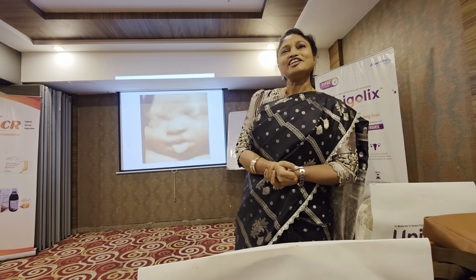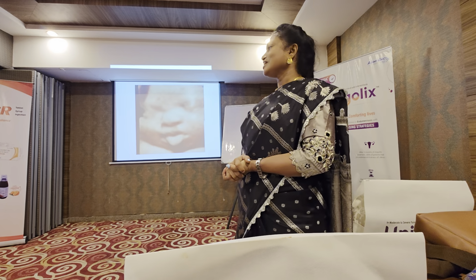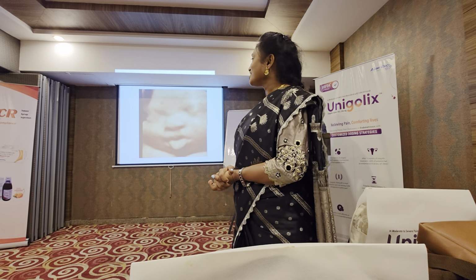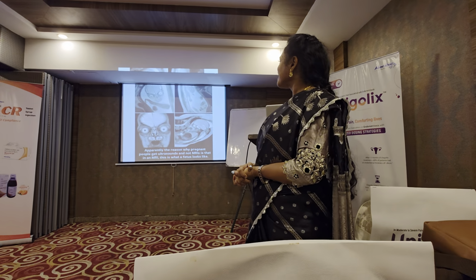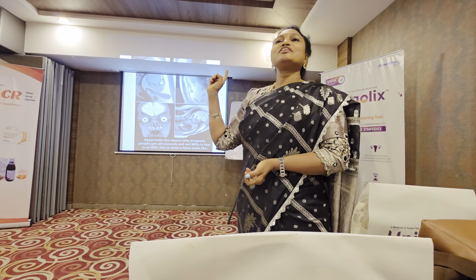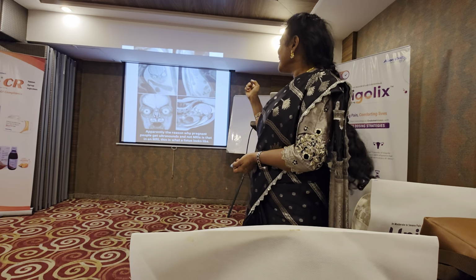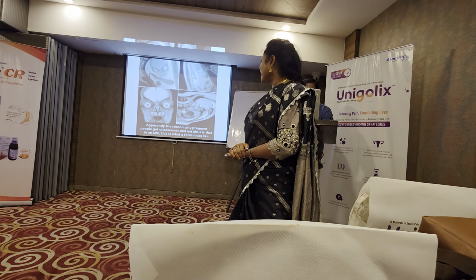So all said and done, I think the baby is teasing us and telling us we'll still have so many things underway. Next one. We may miss so many things. This is how a baby looks on MRI. That's why we do ultrasound. We don't do MRI because it's really scary. Next one.